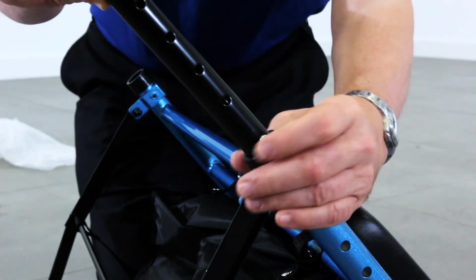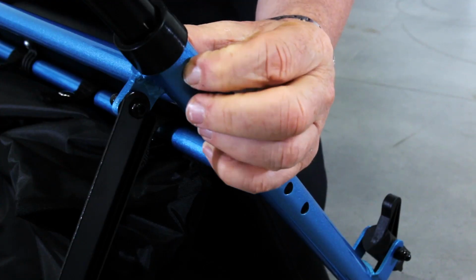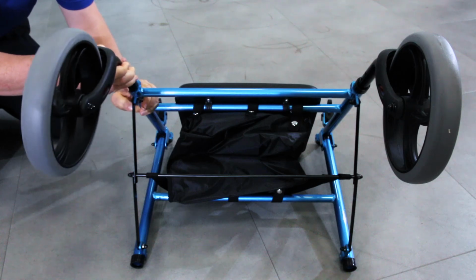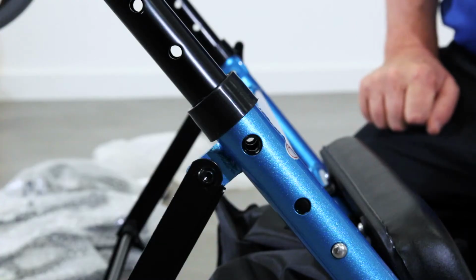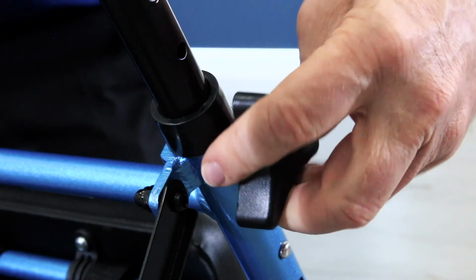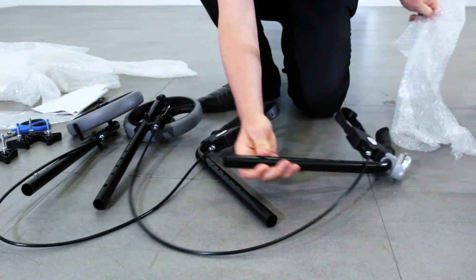Push the leg into the frame. The height adjustable bolt will click when the leg is fixed firmly in place. Push this button again to adjust the height. Make sure both legs are at the same height, then insert the tightening knobs into the frame. This will further secure the legs in place when using the rollator. Repeat this process to attach the front wheels.